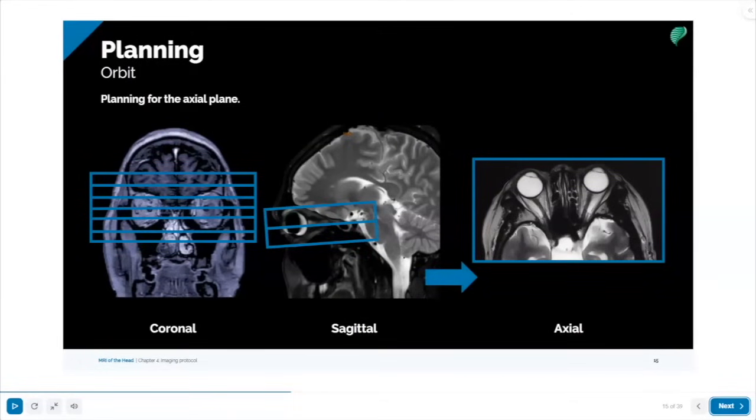One tip that you might have due to eye motion is to cover the patient's eyes with a cloth so that they're not moving their eyes around. If it's still hard to control, you can change your phase encoding direction so that you have another set of pictures with the motion going in a different direction.